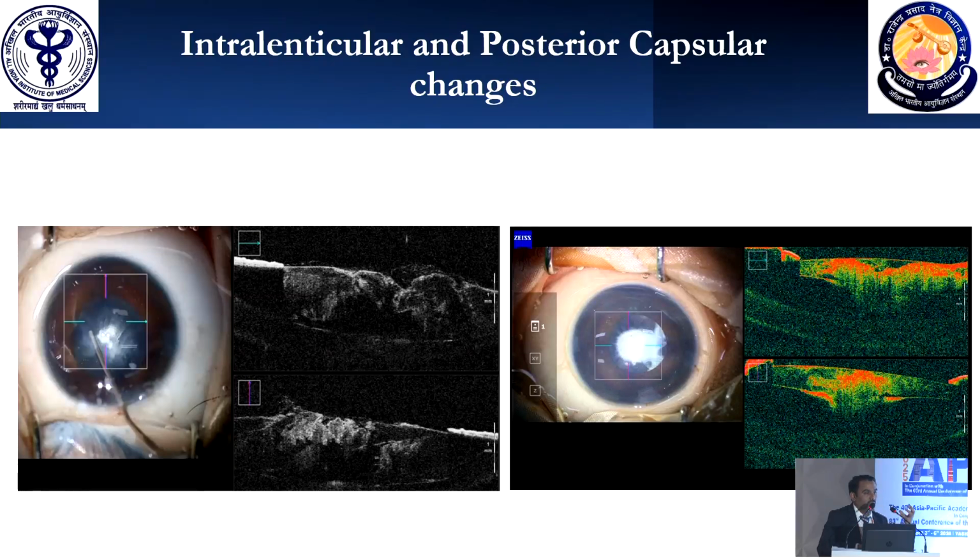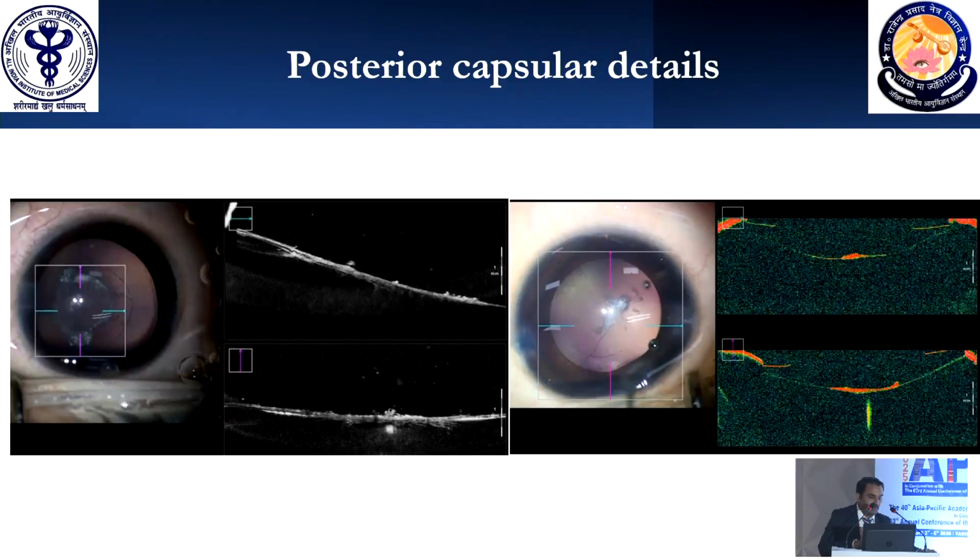Of course, the vitreous is going to be firm in pediatric cases, but here it can go into the anterior vitreous, and of course in some cases posterior vitreous also. But by using this image, you can be more sure, you can prepare your minds, and you can change your parameters. This is one more interesting case scenario.